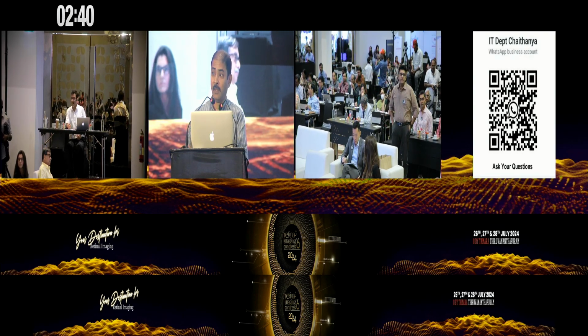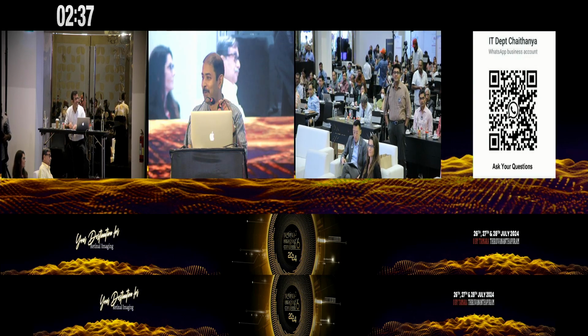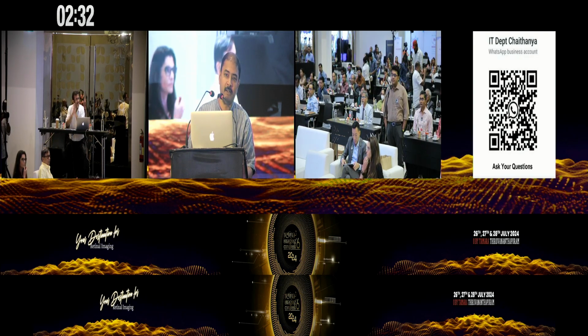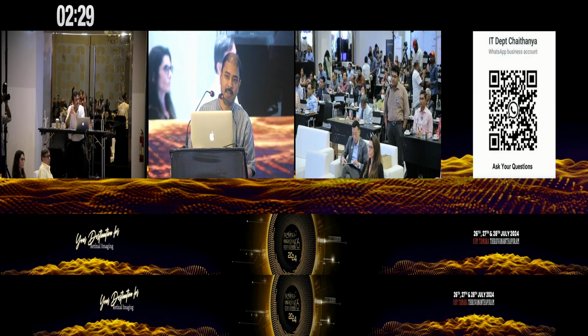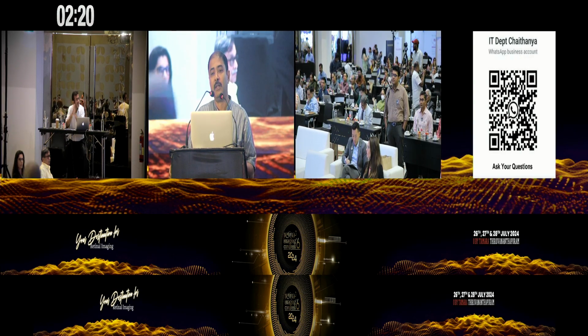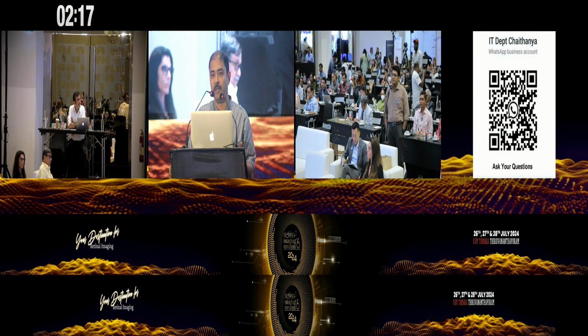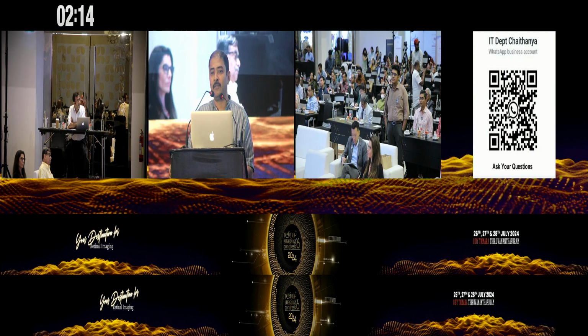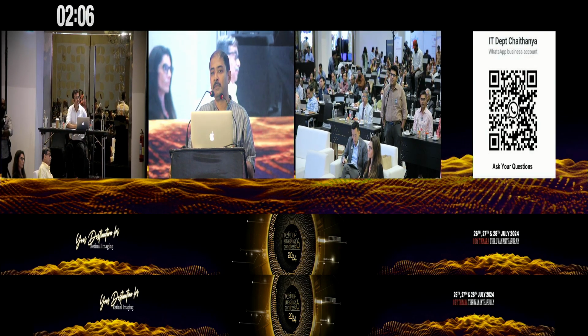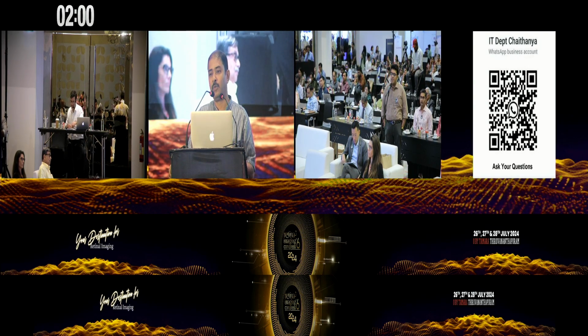Yeah, sure. So your question is whether it is an MNV-related fluid or a GA-related thing. The first thing is that on an OCTA or even on an angiogram, you will pick up your MNV. Now, MNV can be associated with geographic atrophy, but geographic atrophy per se is not the reason for your fluid. It's almost never the only cause of your fluid in the complete absence of a neovascular process. So if you're not picking up a network, then I don't think that I would blame the GA for the fluid. So every fluid in a GA patient is because of macular neovascularization?